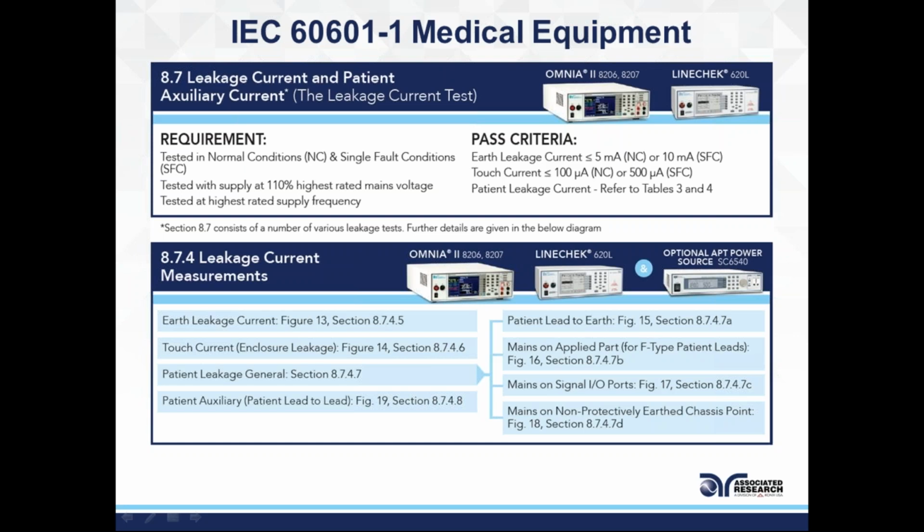Now, what are the passing criteria? So we talked about the requirement. You have to power up the device you're testing, make the connections to make sure the probes are connected properly, and then make sure the voltage is at the right voltage, and then you have these simulating conditions. So these are all the requirements to get this test set up. But what is the passing condition?